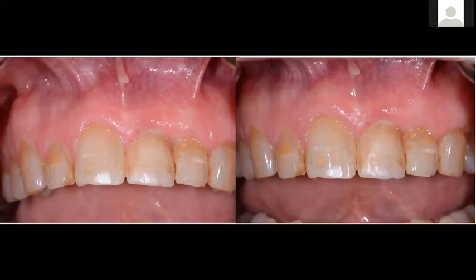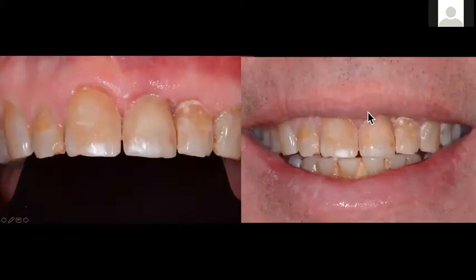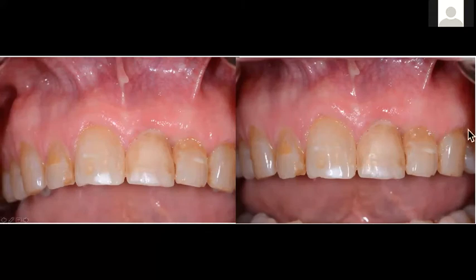If the implant does have good primary stability, then Dr. Kevin Kvechen, one of the resident prosthodontists at Spear, went ahead and temporized this implant with a provisional. This was the first provisional to start to condition the soft tissues here. And you can see nicely the root coverage that we achieved with the connective tissue grafting, to be able to put these at the same level as the contralateral teeth, and also to bulk this up with the connective tissue graft.